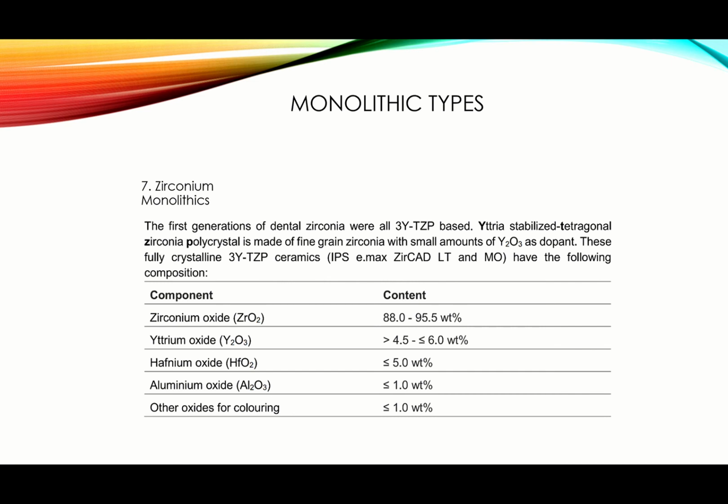How do they play with the content? A little bit, on a basic level, we're going to discuss that. Not very deep, but at least you'll have a hunch, a sixth sense, if somebody advertises to you, oh, now we have cubic zirconia, oh, now we have high-content tetragonal zirconia. This is a try from me to help you elevate your knowledge about the zirconia block, so you can at least say, oh, this doesn't make sense, or I need more information about this, or okay, you give me more translucency, but is it weaker now?